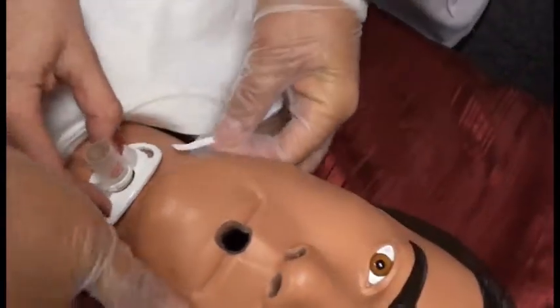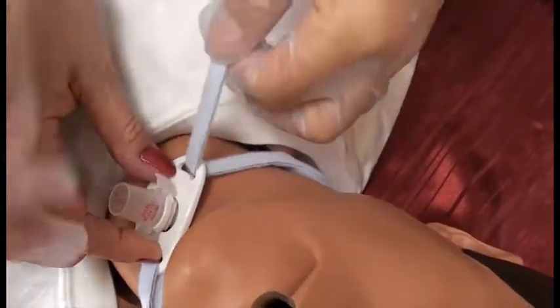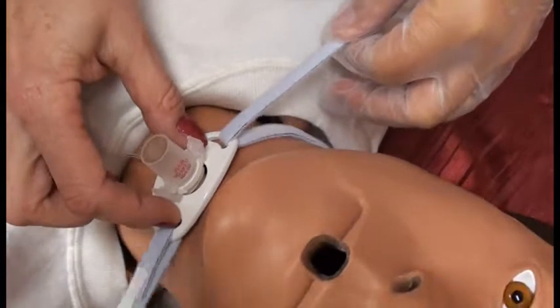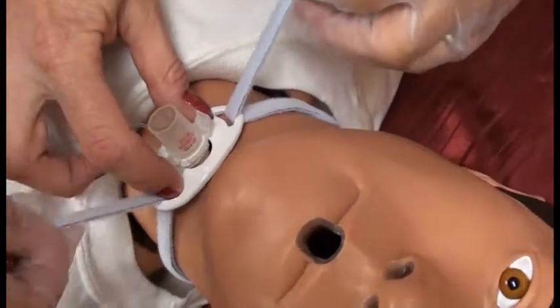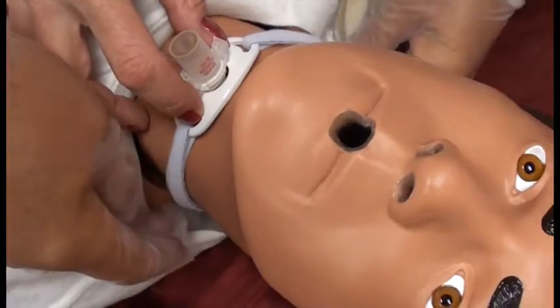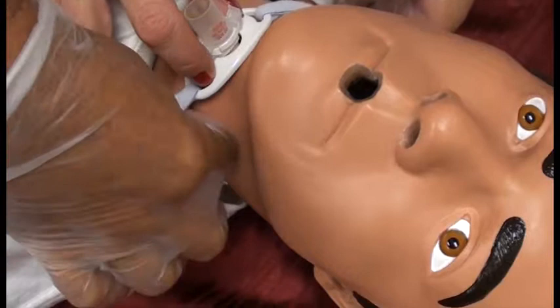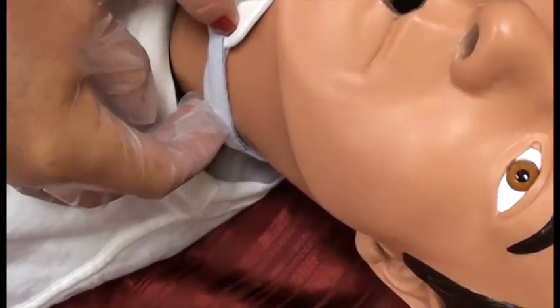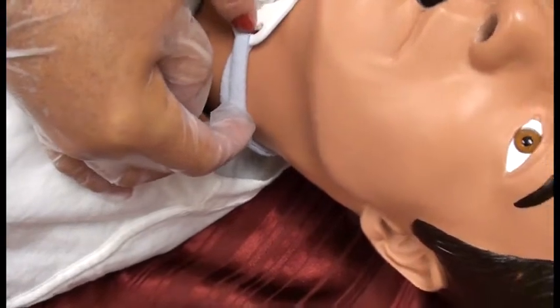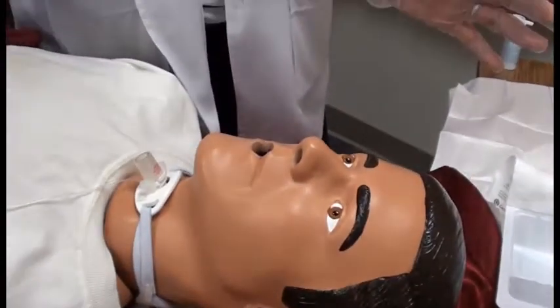Oops, there goes my head. Okay, what you want to do is you want to make sure that the trach tie is snug, not tight. So after you put it on, you must be able to put a finger or so inside there so that the patient is comfortable with that trach tie. Okay, so now our tracheostomy is secured, it's not going to go anywhere.